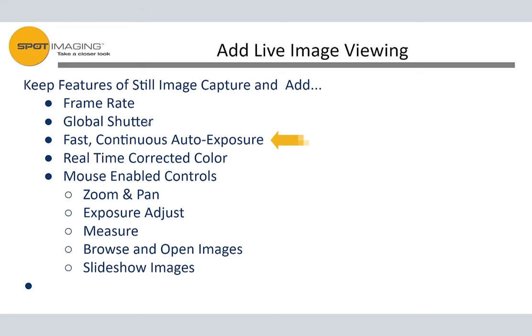You want something that's like in the half a second or 3/4 seconds, typical update on the exposure time. So that's important. Another thing is in real time, you actually want all these color corrections, and that's a hard thing to do, and many companies don't do that. They give you kind of a raw image. For example, we've seen the Optronics 4K cameras and their HD cameras.